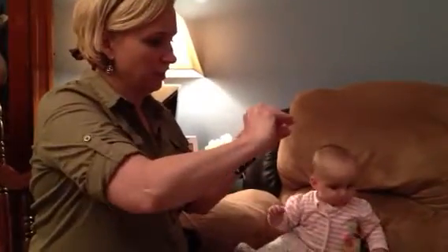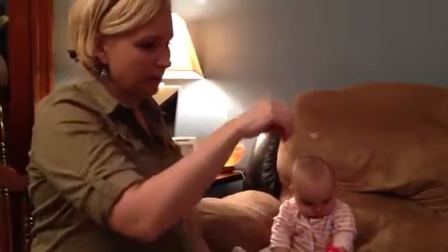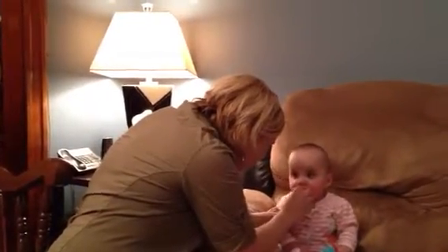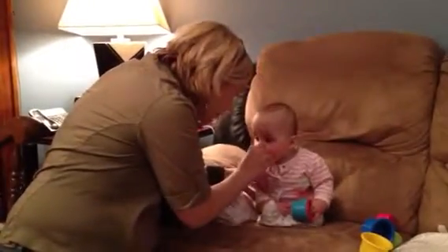All I do — it's like a Q-tip. You break the swab until you hear the little snap. There's the snap. The liquid then comes down into the swab, and then all we do is we clean Mary-Kate's lower teeth, and we clean her upper teeth and gums, and she likes the flavor, and she's happy, and it's as simple as that.